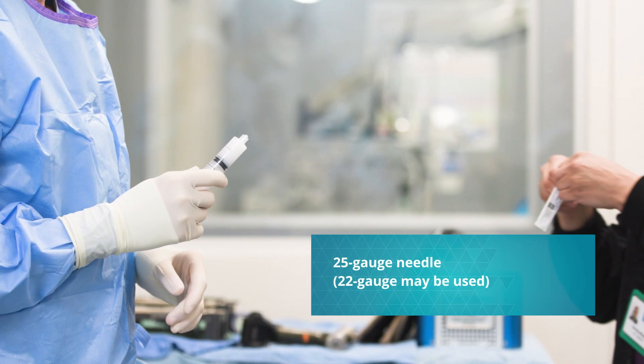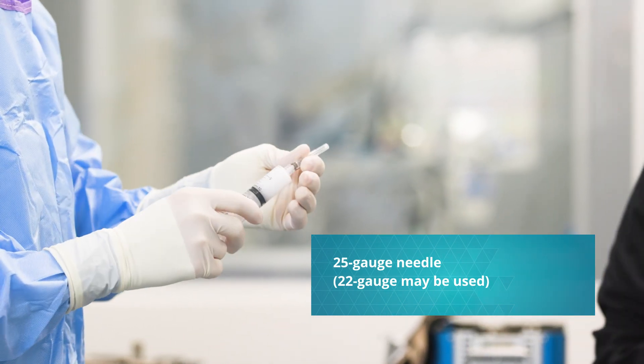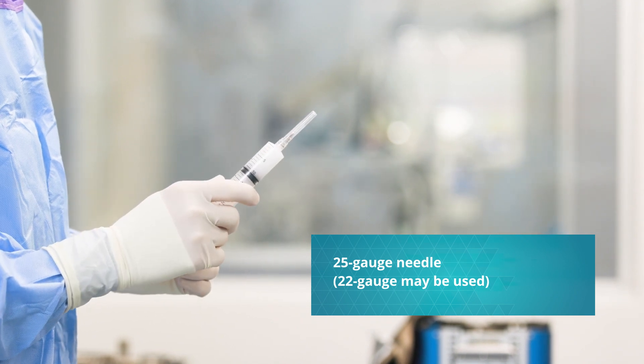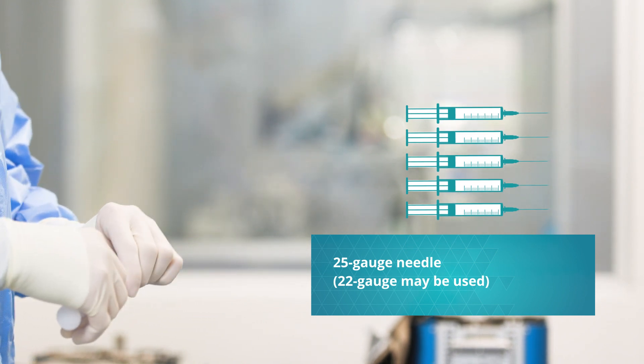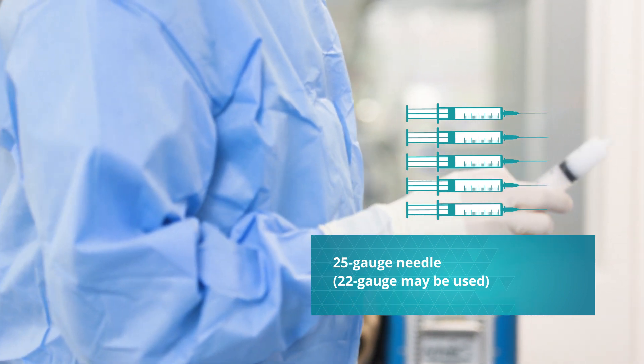For the administration of Nesita, use a 22 or 25 gauge needle depending on the size of your patient. Do not use a needle gauge smaller than 25. Consider separating the patient's volume-expanded dose into different syringes. Having separate syringes for each tissue layer can help ensure accurate delivery to each layer.